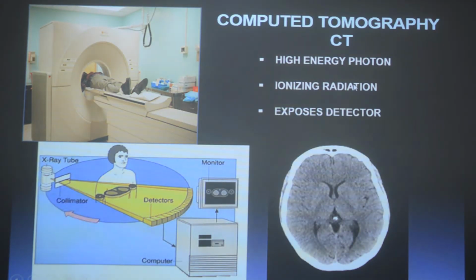Okay, since you have not studied CT and MR, I have to give you a little more detail on what CT and MR mean. In CT, you are using radiation. It is an X-ray machine, with a tube which emits the X-rays, they pass through the patient, and then there are detectors which detect the X-rays that have come through the tube and past the patient.